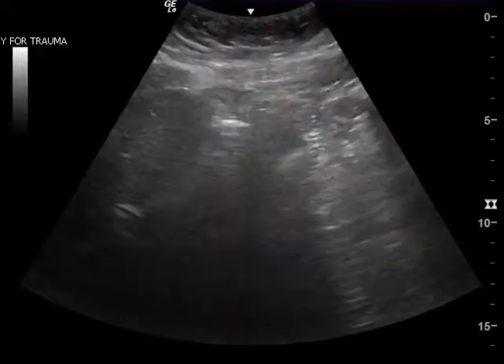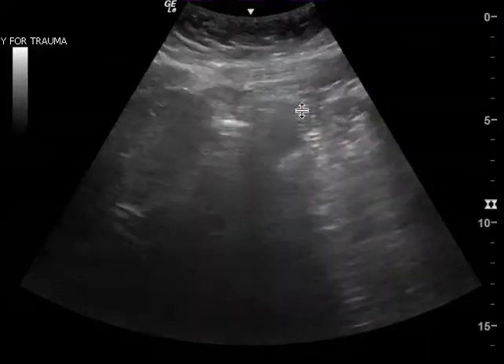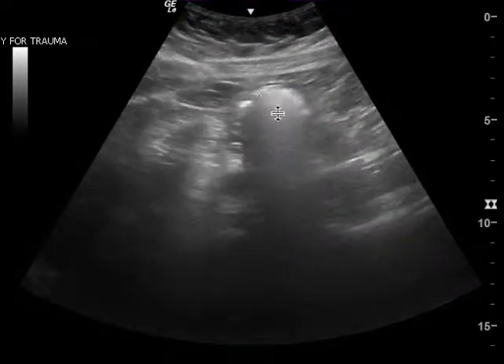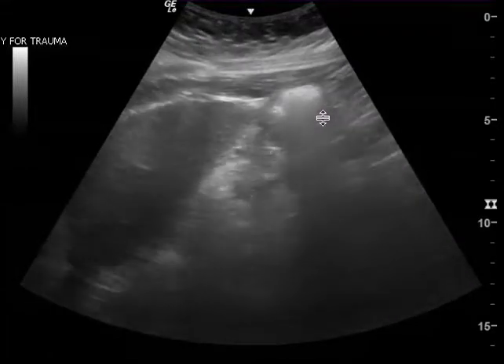This is a gallbladder ultrasound — I just want to go over all the clips. In the first clip, you can tell this is the duodenum here. It's the hyperechoic dirty shadowing that illustrates that. You don't see the gallbladder in this clip.